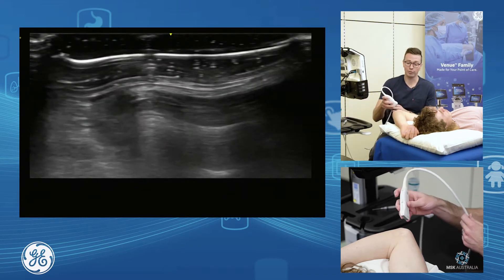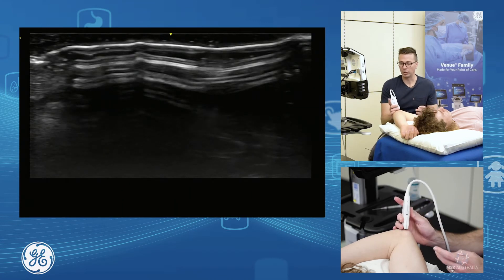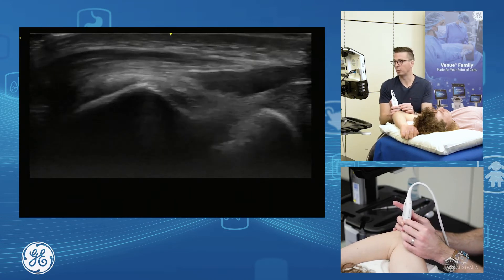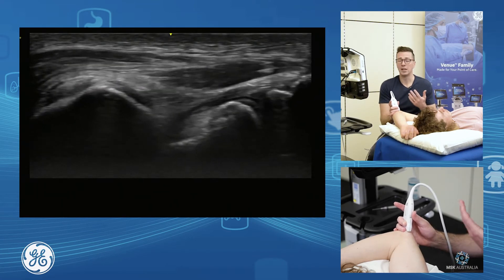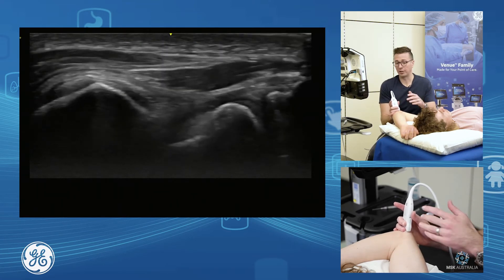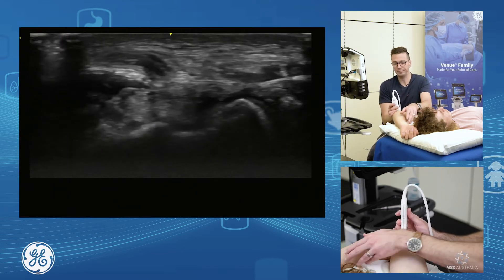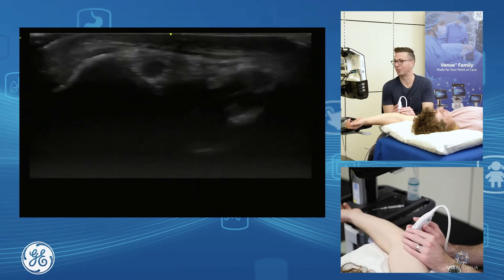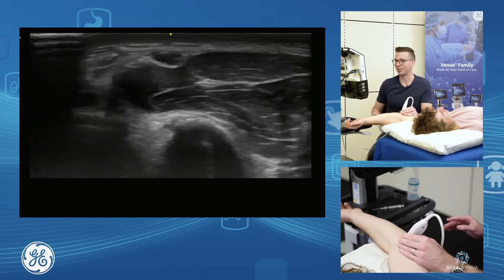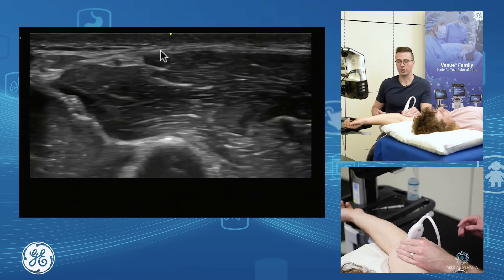The other thing we're going to talk about is the ulnar nerve. So in this position, I'm going to palpate his ulnar groove and put my probe in the middle to find his ulnar nerve. We already know in this patient it's sitting dislocated — with elbow flexion it's sitting up and over the common flexor. I'm going to put him in a bit more extension so it clunks back into position. We can grab down through here, track proximally, and see the ulnar nerve sitting up through here.